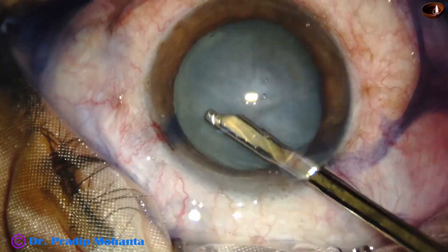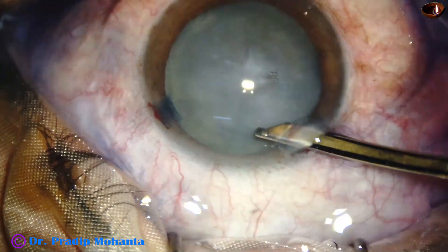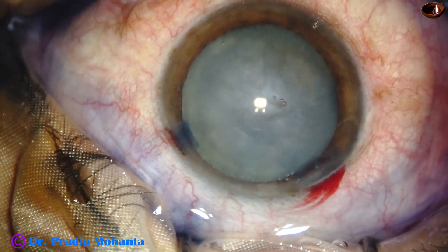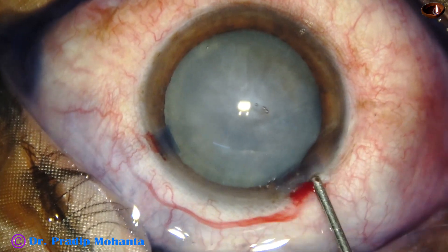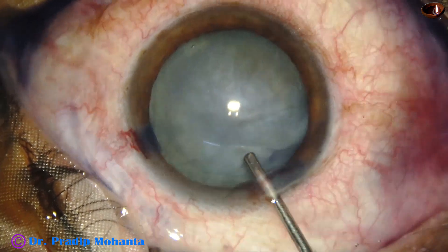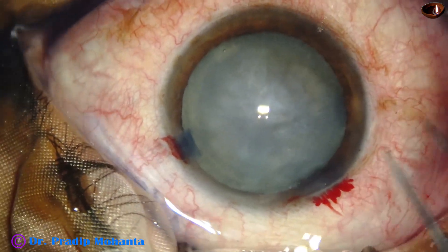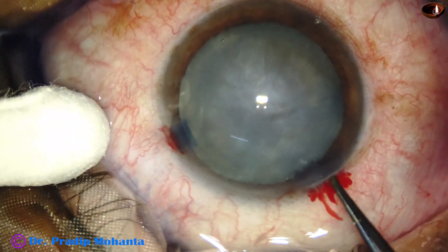We can see there is very nice staining of the capsule in a very short time. And now the anterior chamber is filled up with 2% hydroxypropyl methyl cellulose. Now, let us see capsulorhexis with the utrata forceps.